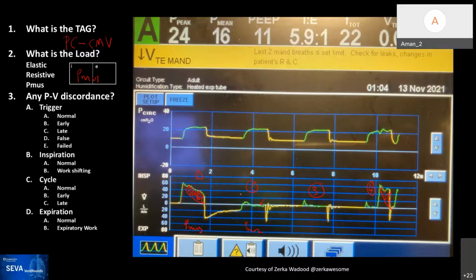Yeah, that's a great question. Rob, what are you thinking here? Well, it starts off looking like it's exponential, but then it sort of flattens out. So you have a constant expiratory flow. And then the ventilator tries to cycle, tries to trigger, and the patient apparently is continuing to breathe out for the next 2 or 3 seconds. Yeah, the next 3 seconds, he's still trying to breathe out forcefully enough that the ventilator cannot cause the flow to substantially go above zero.